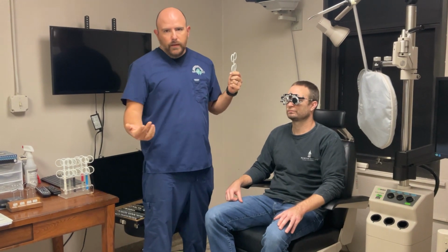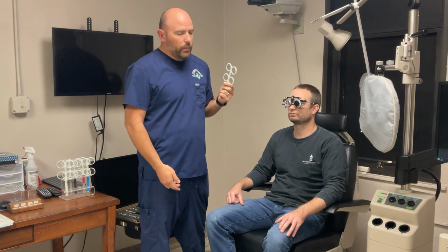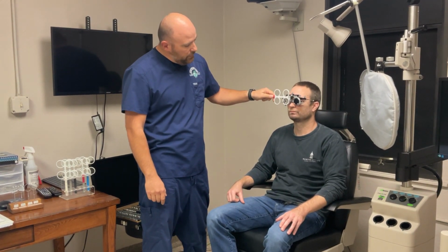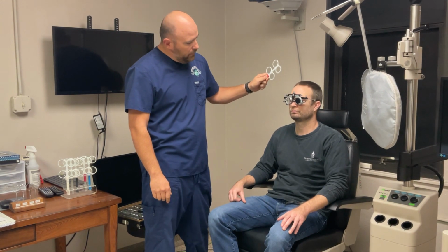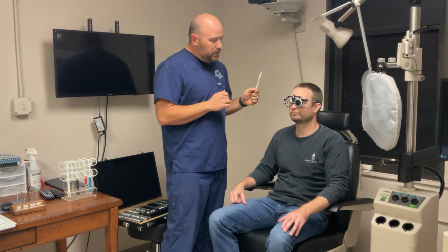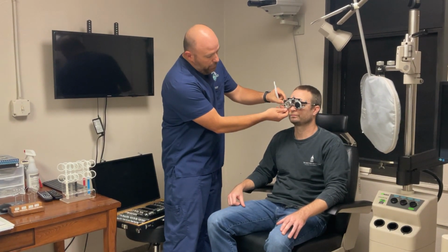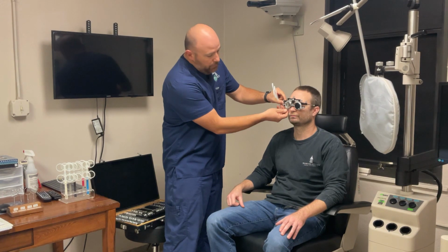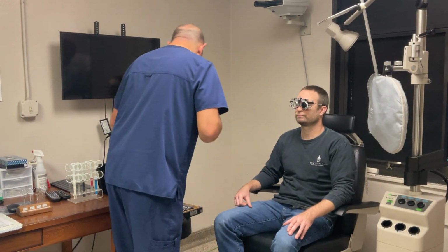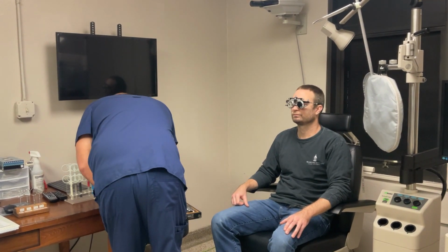Okay. The other thing that a clinician may say is with the lens or without the lens. That's fine as well. So I'll show you that one here. All right. And how about with the lens or without the lens? With the lens. Okay. So the patient wanted more minus, and so I'm going to very gently pull this lens out while grasping the trial frame so that it doesn't pull or torque on his face. So let me grab, this was a 350, I'm going to grab the 450 here.